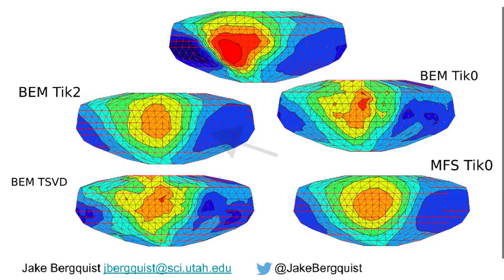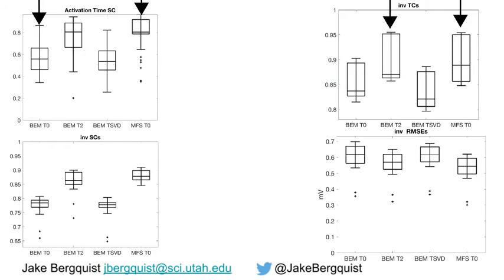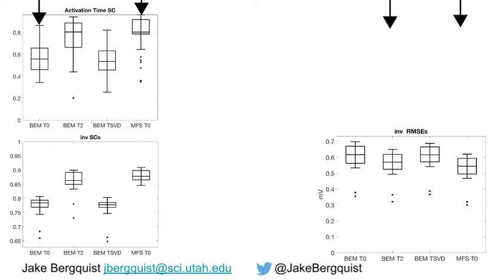formulations. For example, by assessing the four inverse methods that we showed here, we saw a striking similarity between Tikhonov's second order boundary element method and method of fundamental solutions Tikhonov's zero order. These two methods proved to be more accurate according to some of the more traditional metrics, such as spatial and temporal correlation and RMSE.